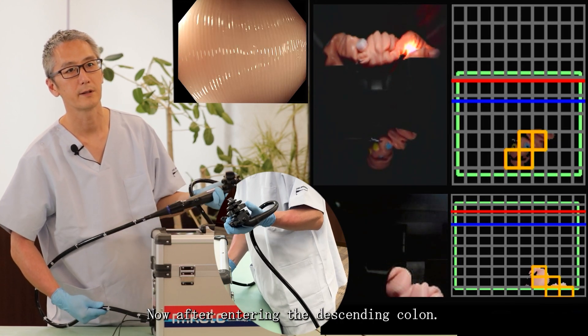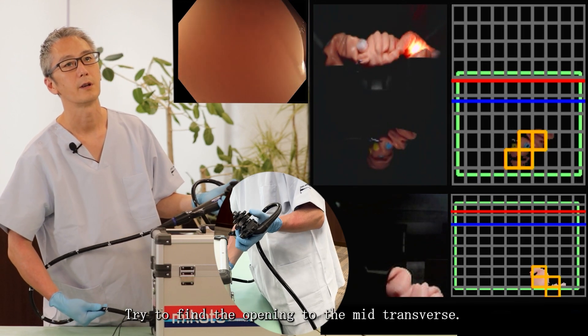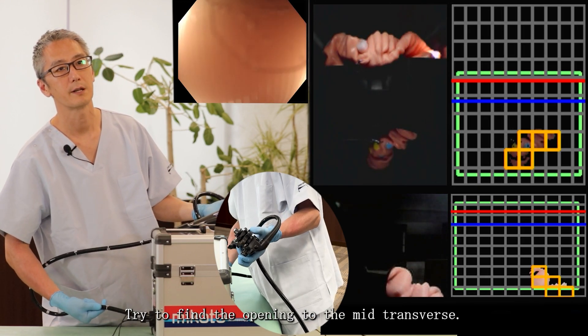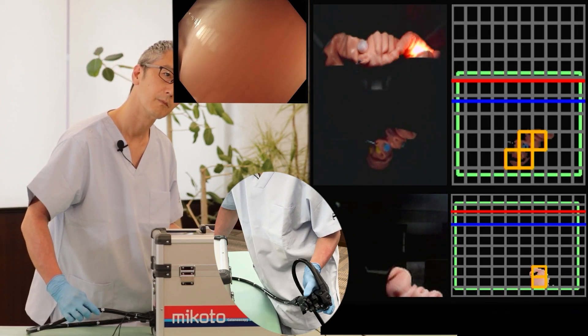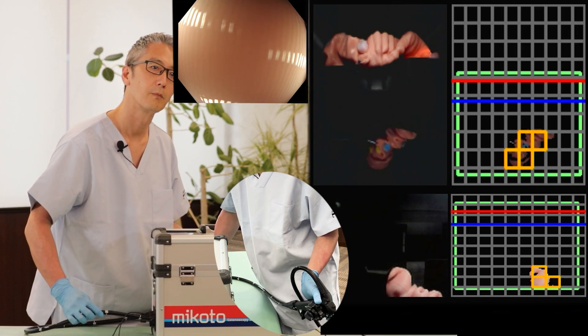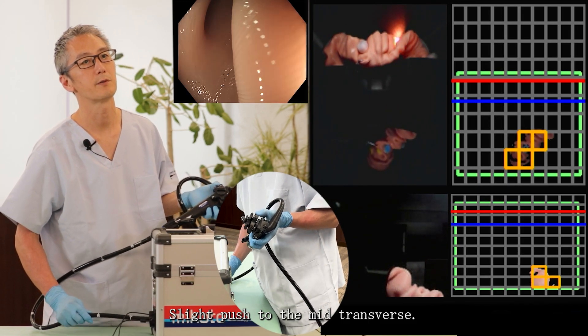Now, after entering the descending colon, try to find the opening to the mid-transverse. Apply a slight push to the mid-transverse.